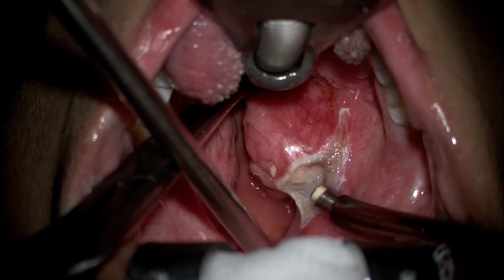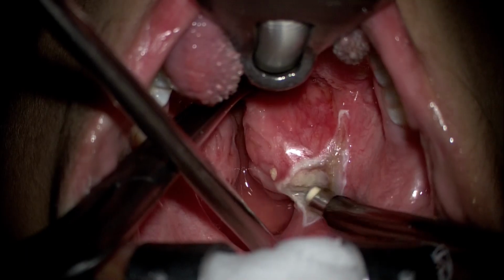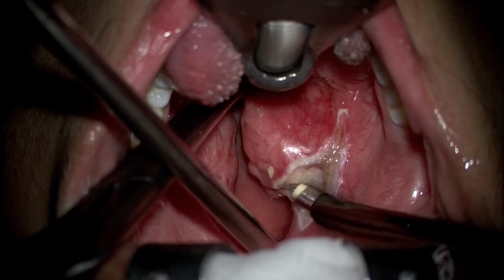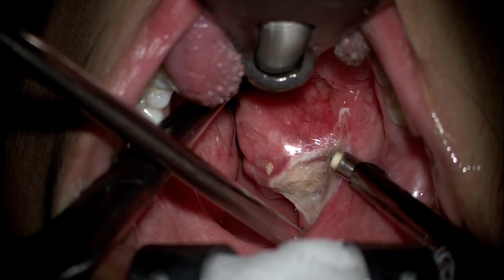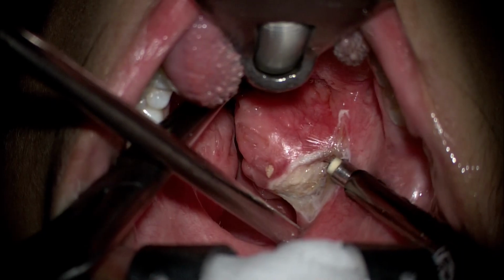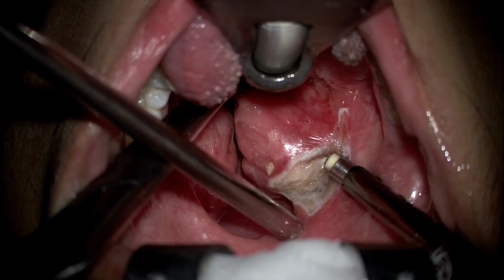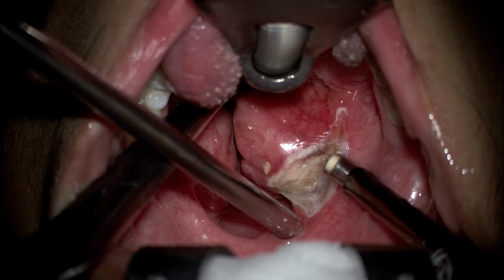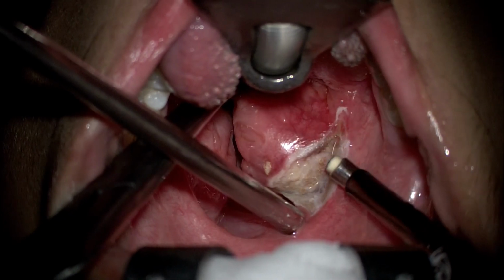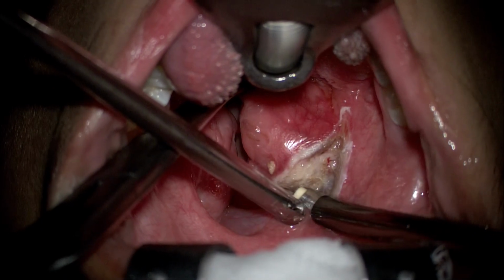Most of the surgery is conducted using the ablation mode of the coblation device. However, in case of some bleeding, one can easily switch to the coagulation mode as well. Now, as we have dissected the superior pole partially, you can see that most of the musculature is spared, and we are carefully dissecting the lymphoid tissue from the connective tissue of the tonsillar bed.